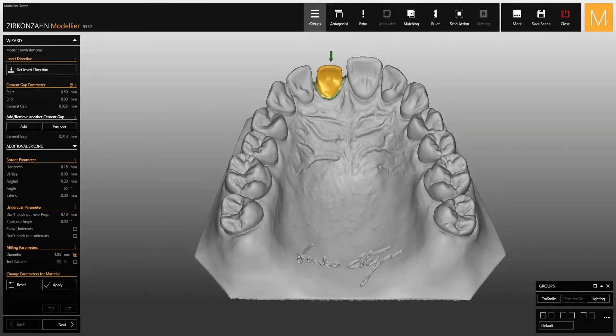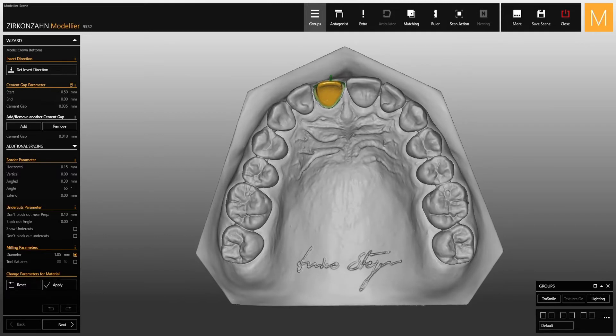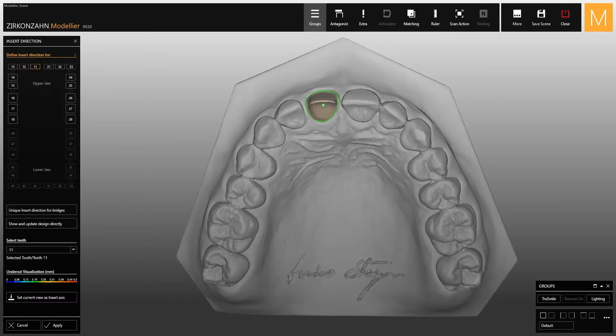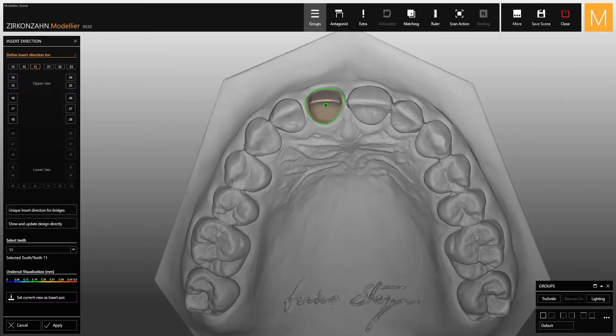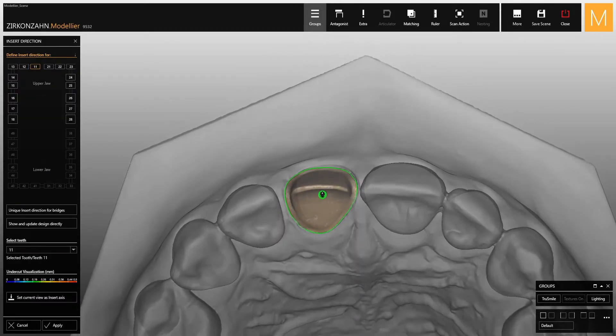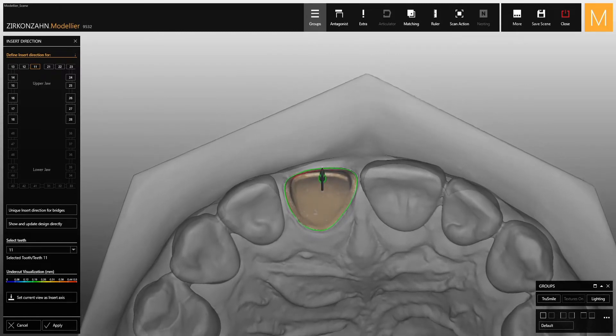This video shows you the new features of the Set Insert Direction function. When the function is activated, there is a light green arrow which can be modified.